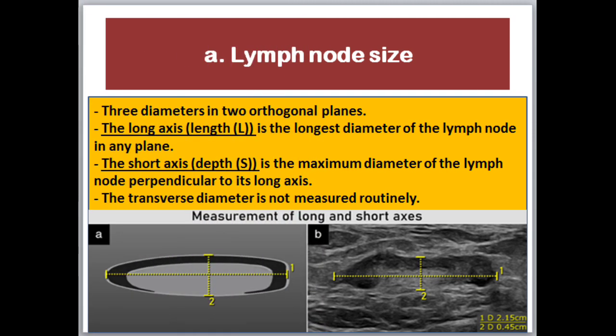The size of the lymph node is defined by three diameters in two orthogonal planes. The length is the longest diameter of the lymph node in any plane. The depth is the maximum diameter of the lymph node perpendicular to its long axis, as seen in the picture. Rotating the probe 90 degrees clockwise, the transverse diameter is obtained, but it is not measured routinely.